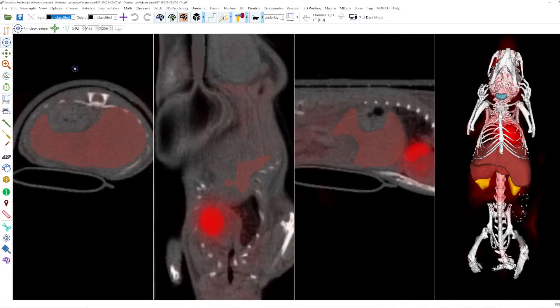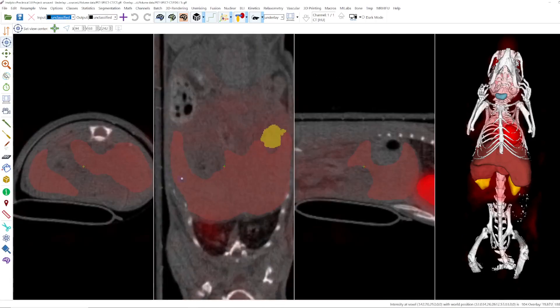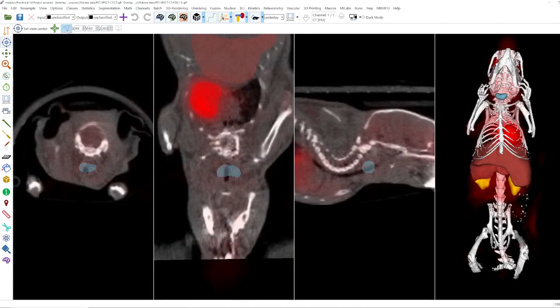We also have some other buttons here. Go to center — it goes to the center of your image. And here we can move the view center to a specific location by entering some values. For example, 90, 40, 385 — click here and now we are in the thyroid again.